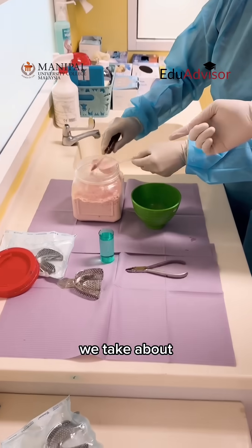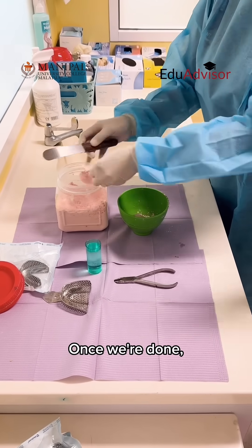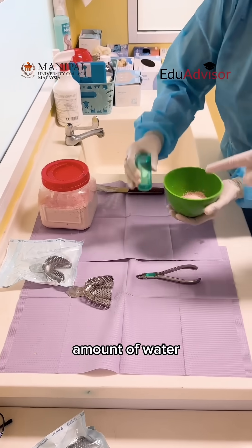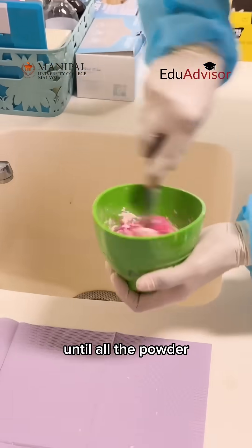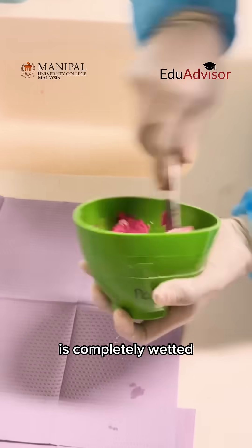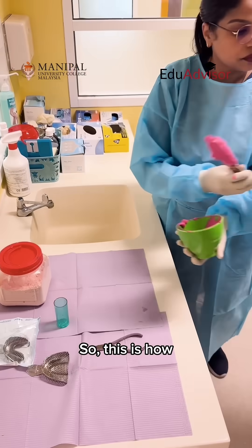So basically we take about three scoops, loaded into the rubber ball. Once we've done that, we have the amount of water which is needed to be mixed with the powder. After that she's going to mix it until all the powder is completely wetted with the water — whip it nicely so that she gets a creamy mix. So this is how they scoop it out.